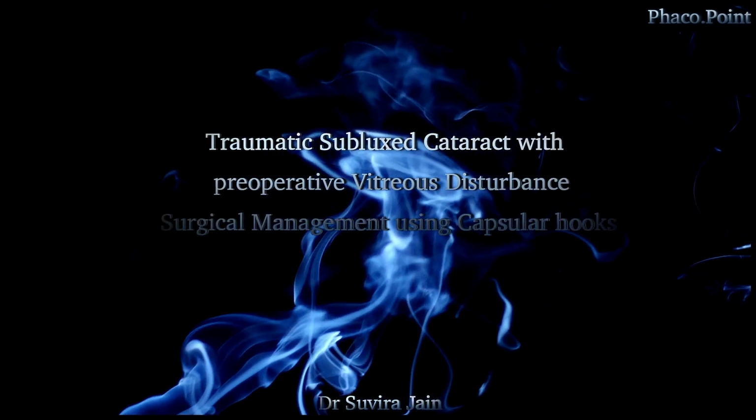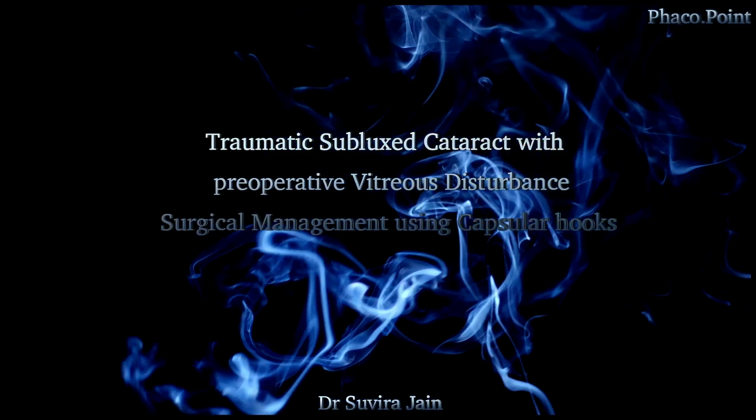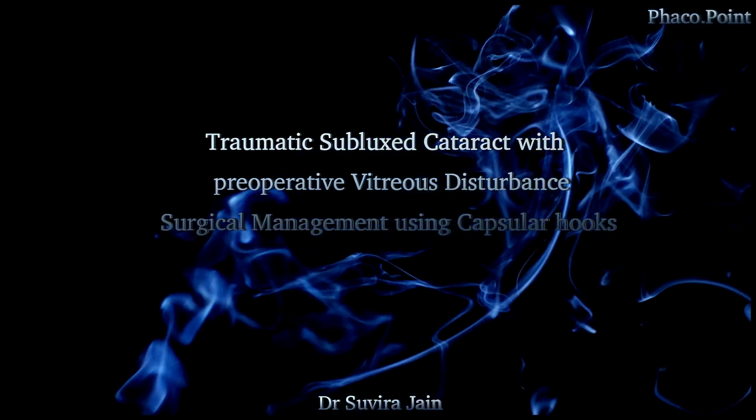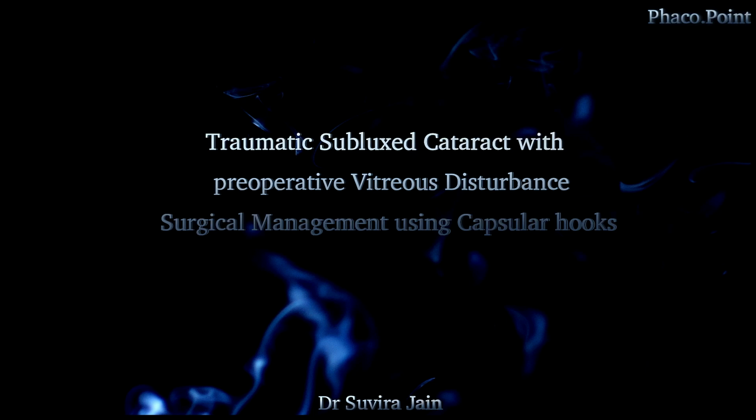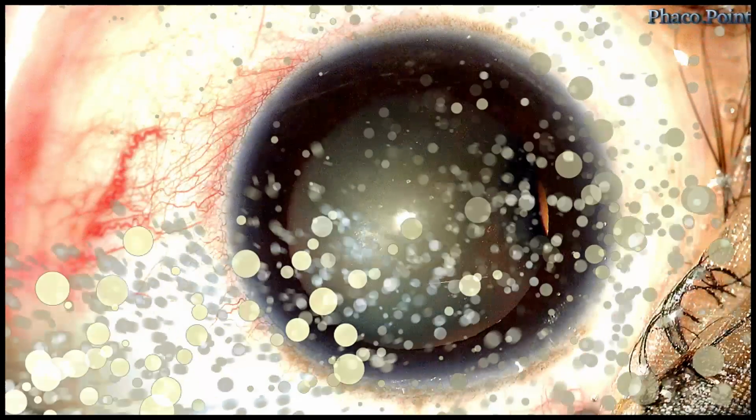I'd like to present this interesting case, a patient with a post-traumatic zonular dialysis with a vitreous disturbance. We'd like to go through the principles in the management and discuss the way in which this case was managed. This is the case.